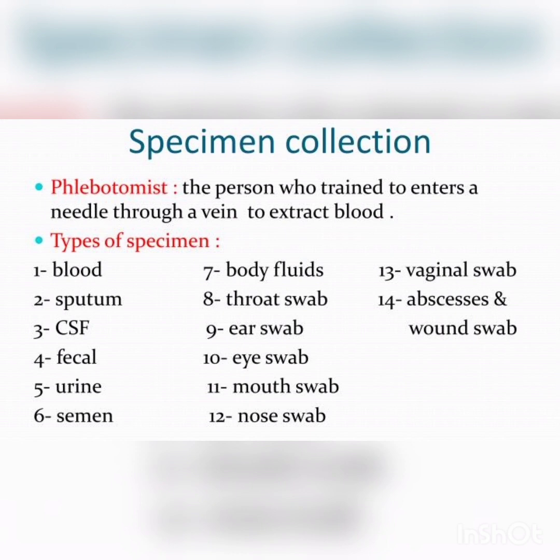It contains thioglycolate broth. You can keep the specimen from the throat, nose, eyes, or ear, wound, or operative site, or urogenital orifices or rectal samples in a small test tube containing thioglycolate broth.